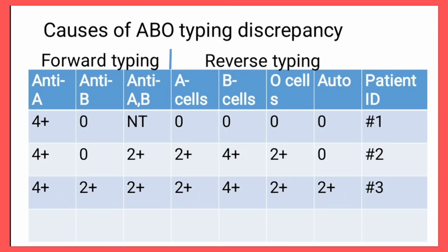I will tell you why. When a patient is blood group A, the person has antigen A and antibody B. We'll come to the antibody later, but for now, the patient has antigen A. If you look at this anti-sera A well, it is embedded with commercially prepared anti-sera, that means antibody A. And anti-B is also commercially prepared, embedded with anti-B.